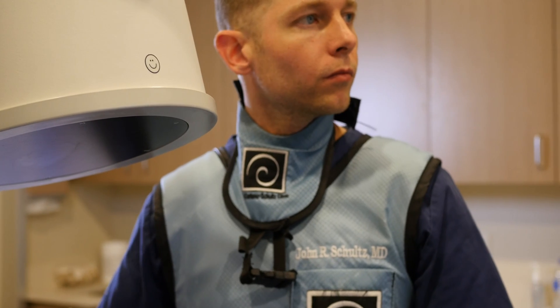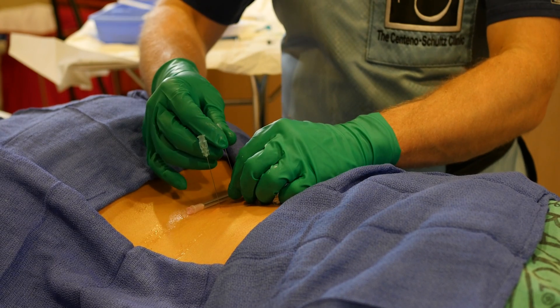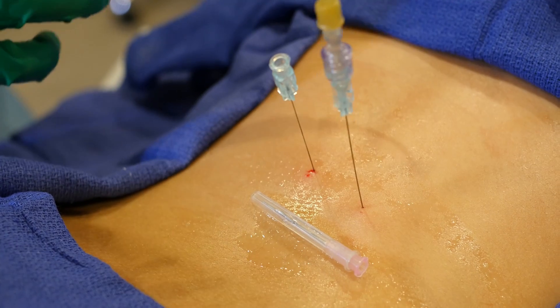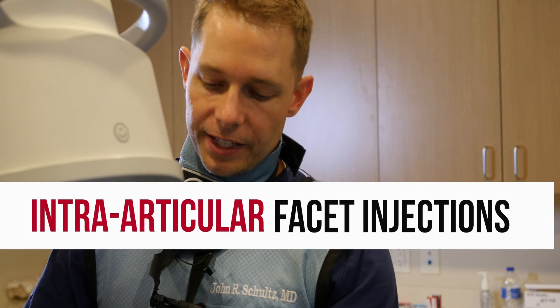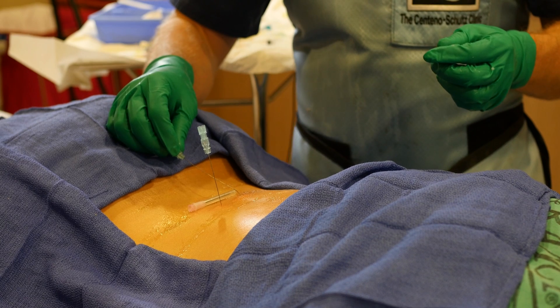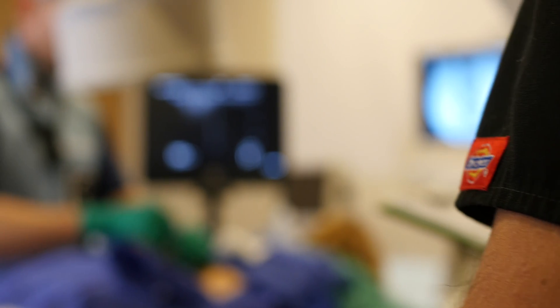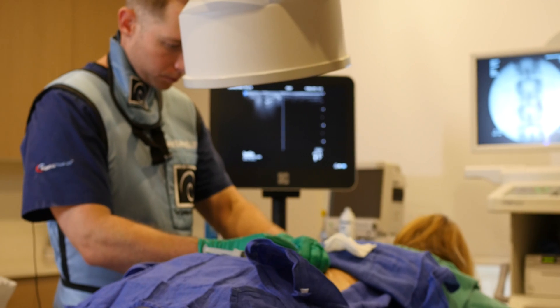Let's take a look at what an advanced interventional orthopedic procedure looks like in the spine. We're doing intra-articular facet injections. As a dancer she does a lot of overextension, hyperextension of the lumbar spine, so it definitely overloads those facet joints. We're helping the arthritis as well as stabilizing all the ligaments in the back.